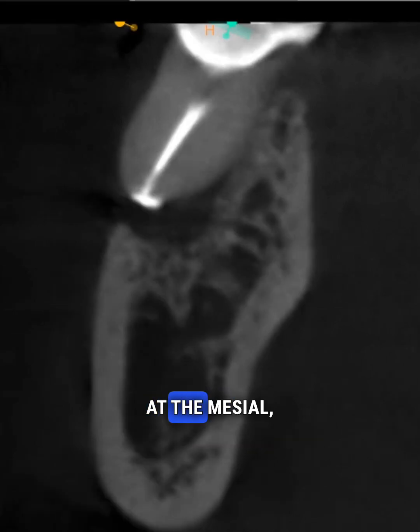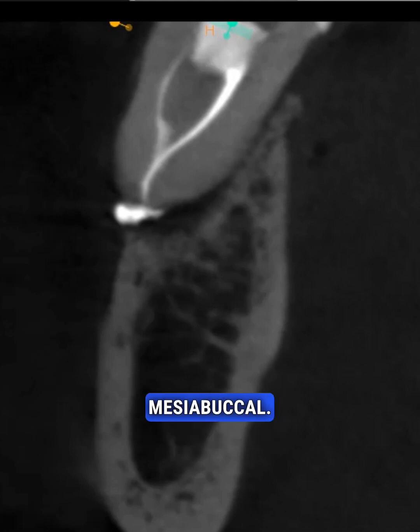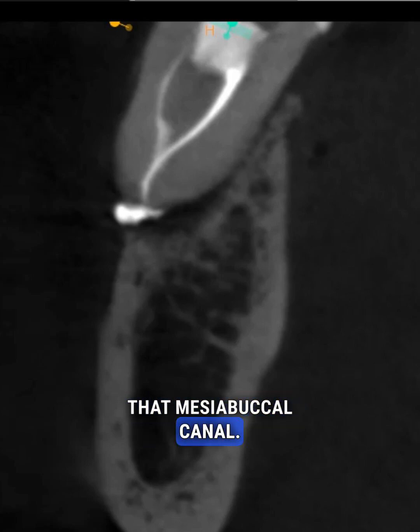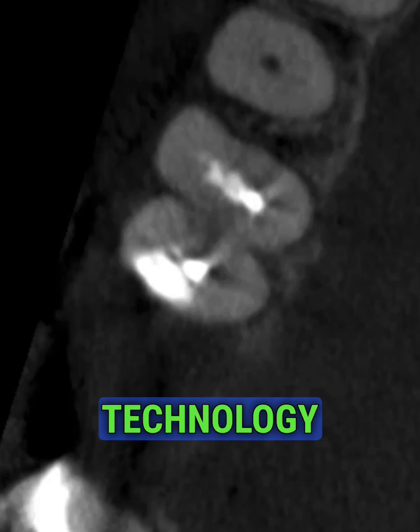Here's the distal, and you can see that. But when we took a look at the mesial, what you're going to see is mesiobuccal and mesiolingual have sealer in them. I never located mesiobuccal. So the laser, I'm using the YSGG with the Edge Pro laser, was able to retro clean with irrigation and all the activity that happens under the laser. And then ultimately sealer was able to also retrofill that mesiobuccal canal. So I actually was able to accomplish full root canal treatment even though I never located the MB canal from the coronal. So this is where the astonishment of technology is.